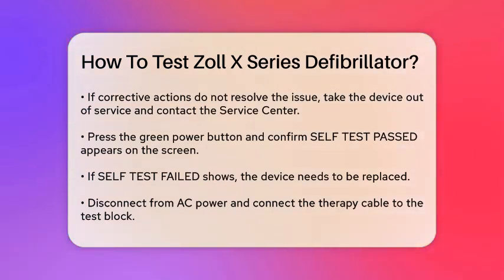Now, press the green power button and verify that 'self-test passed' appears on the screen. If it shows 'self-test failed,' the device needs to be taken out of service and replaced.